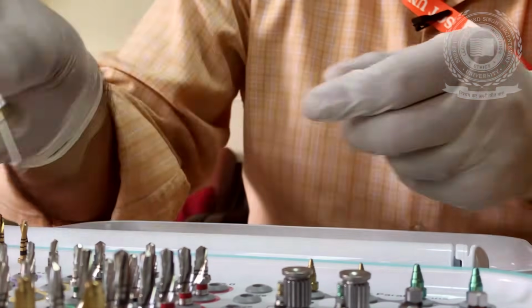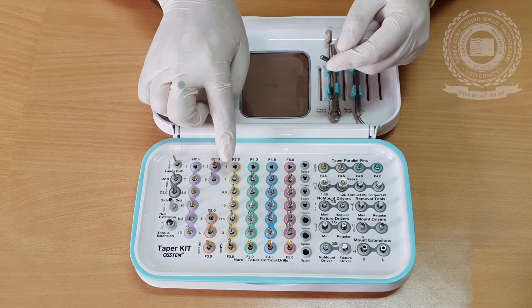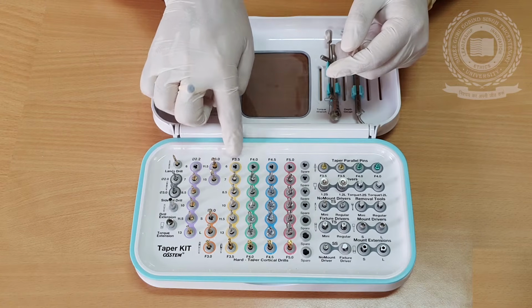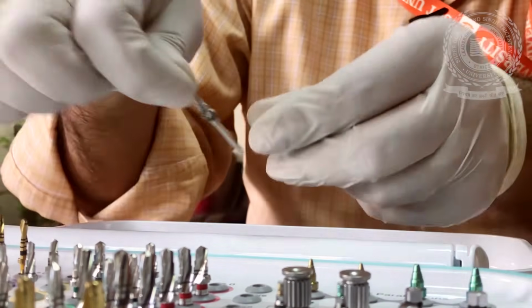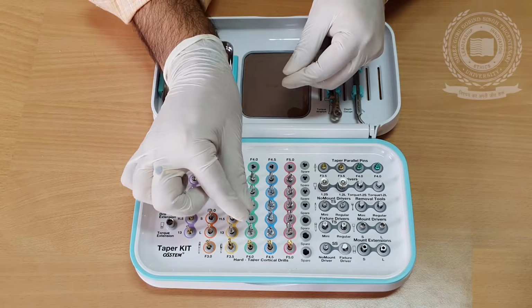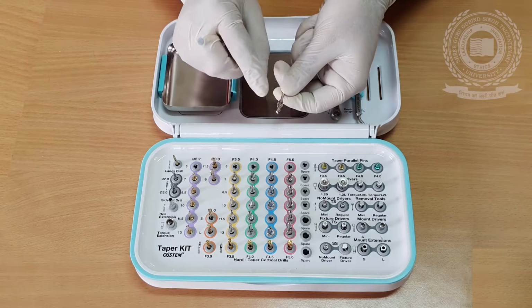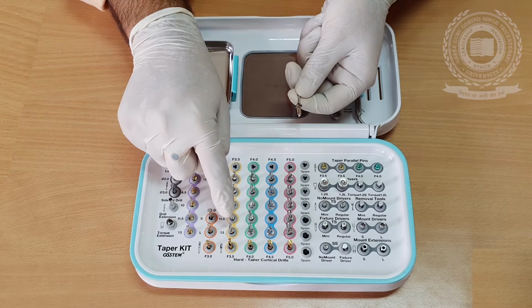So after attaining the depth of 11.5, we can gradually increase the diameter. So we have achieved depth of 11.5 with 3.5 millimeter diameter. Now we can increase with keeping same depth but different diameter, that is 4 millimeter. After that, we can shift to the final diameter, that is 4.5. So like this, we can place implant of 4.5 diameter with 11.5 depth.